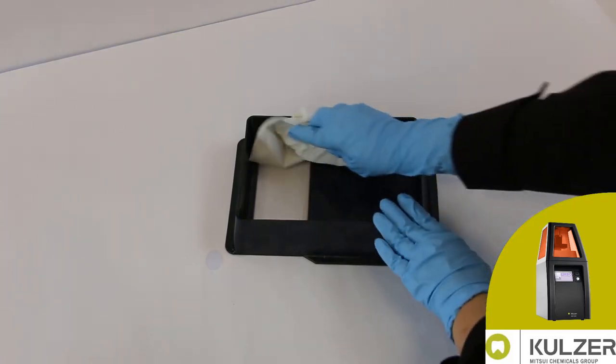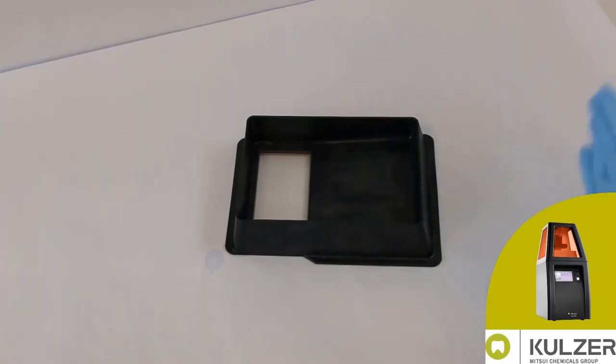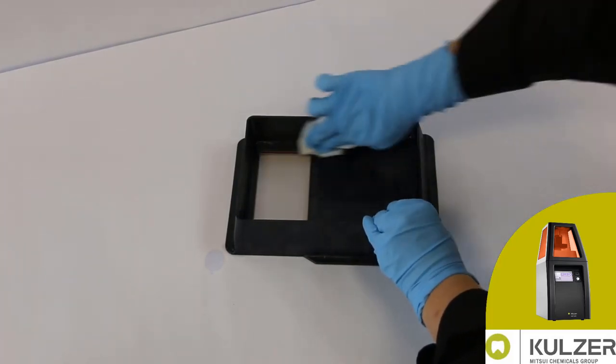If necessary, remove the remaining drops of isopropanol from the surface and dry the remaining parts of the tray.